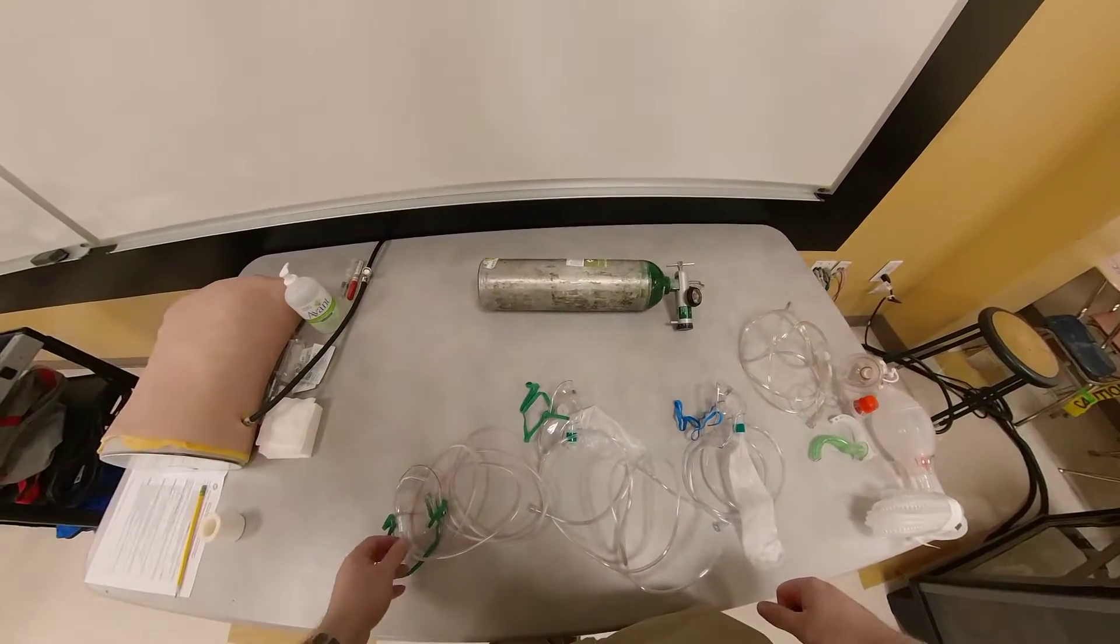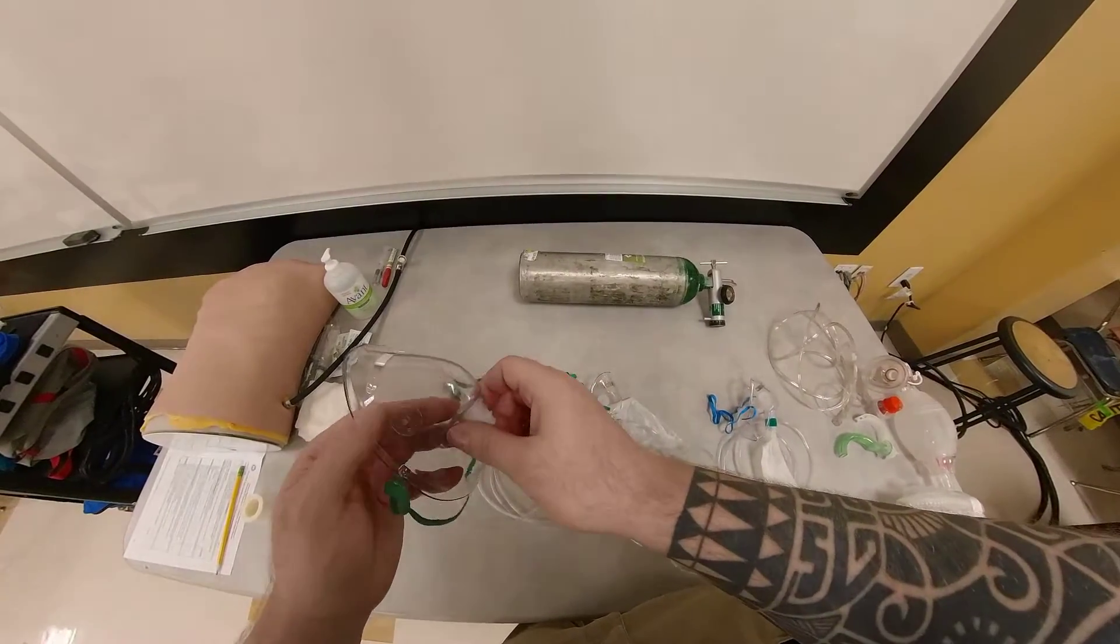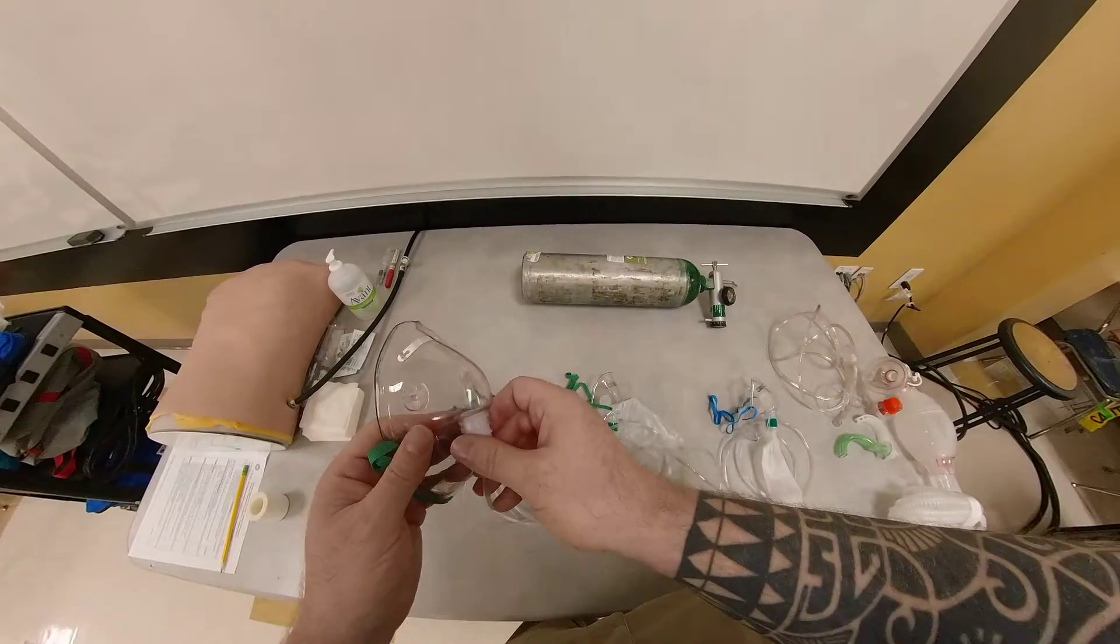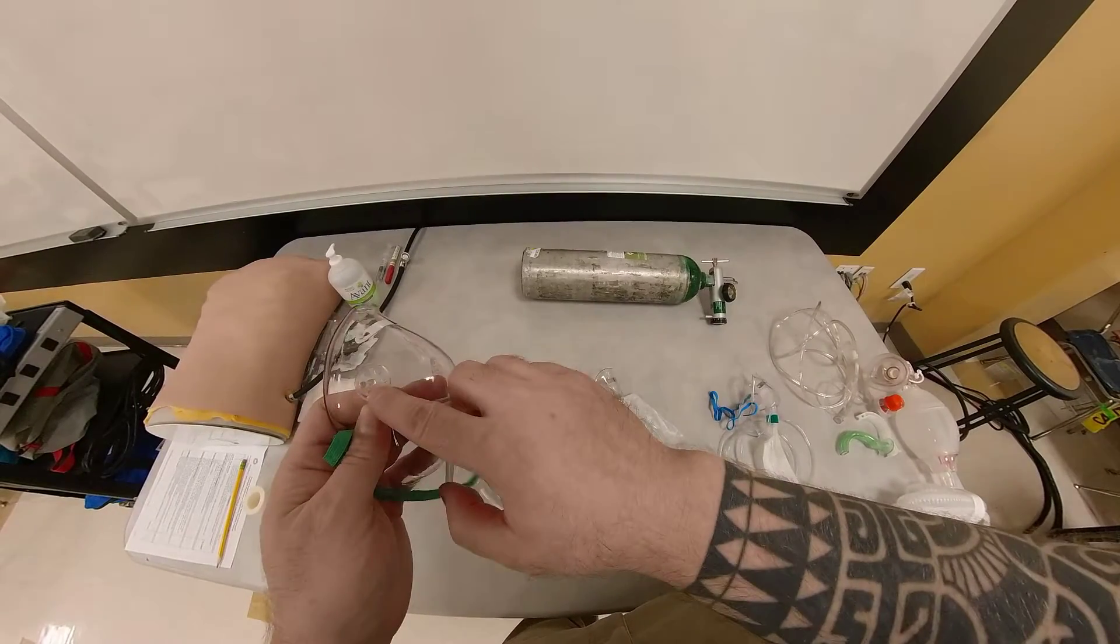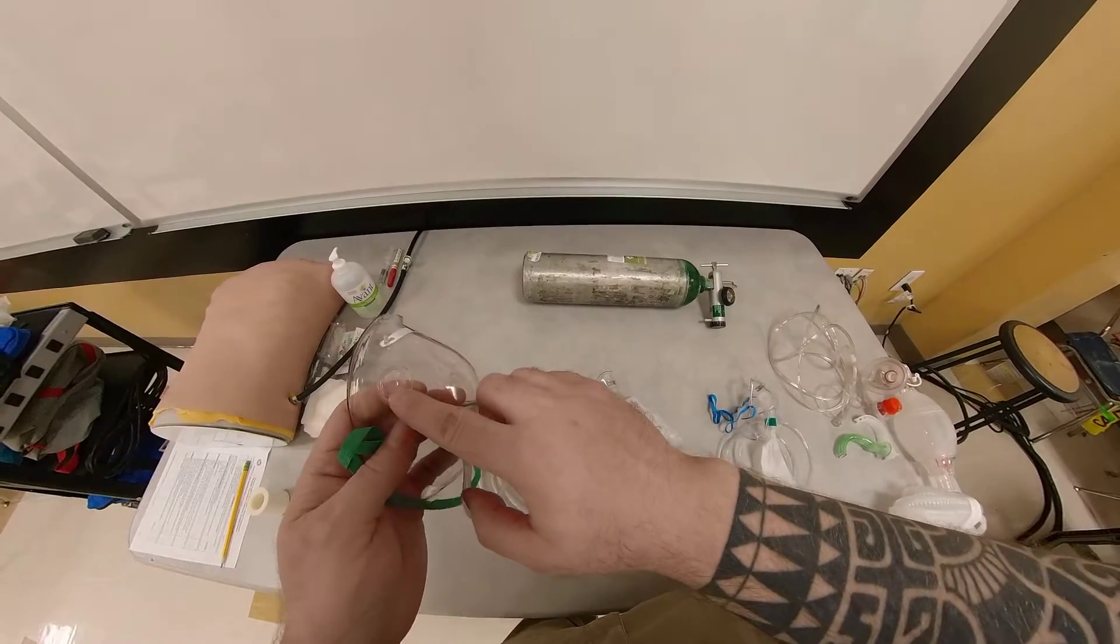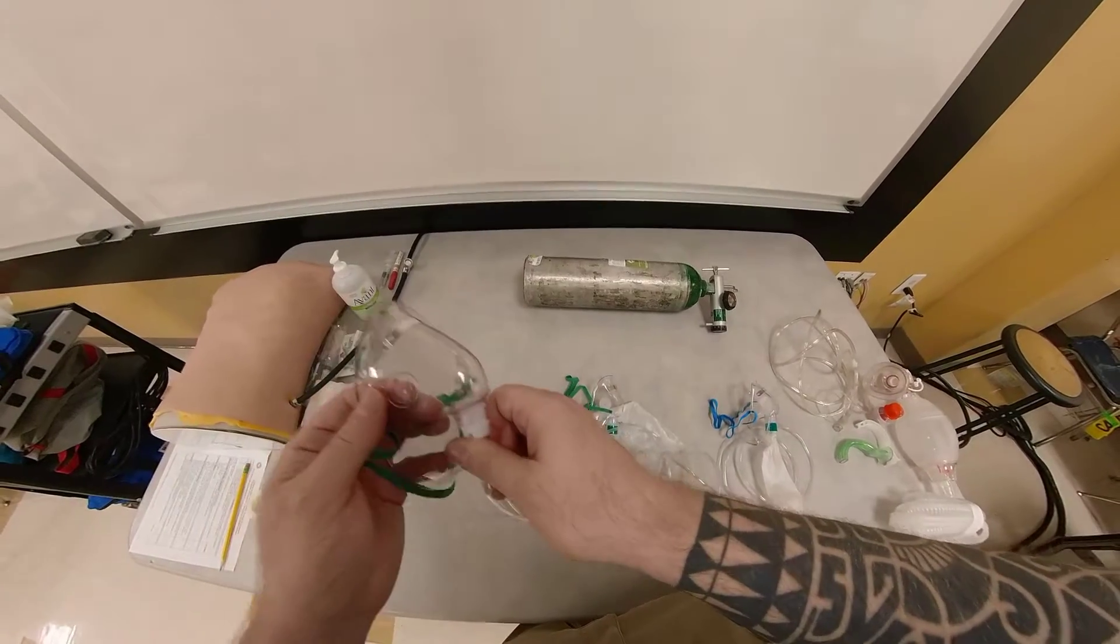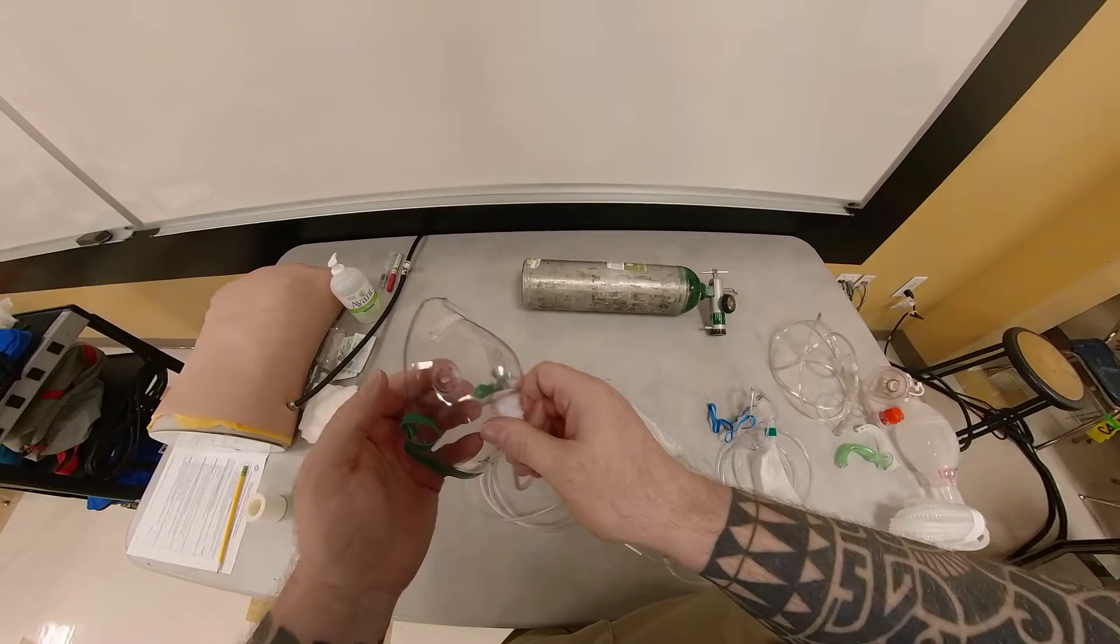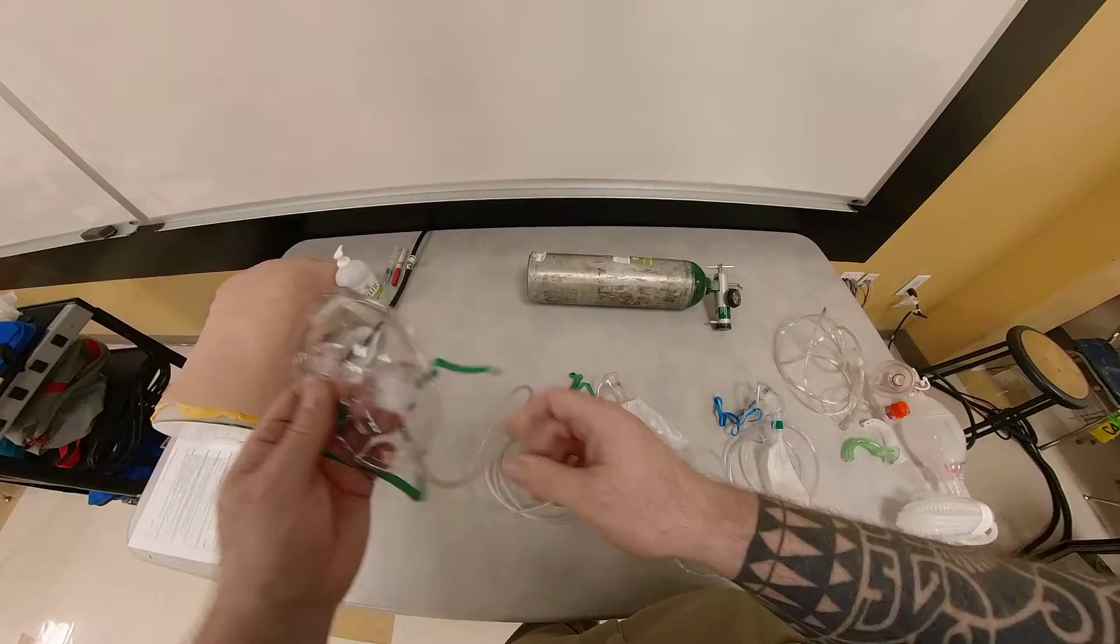So first of all, let's start with something basic. This here in my hand is called a simple face mask, which you notice doesn't have a reservoir bag. And also, if you look at these openings here, there's no one-way valves. So there's openings that connect this to room air, and room air is composed of about 21% oxygen and 79% nitrogen. So the patient is not getting 100% oxygen through this device.